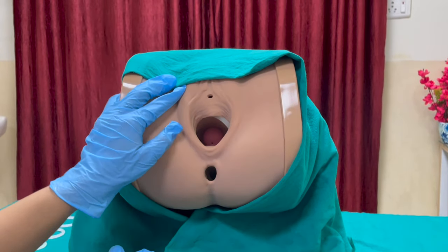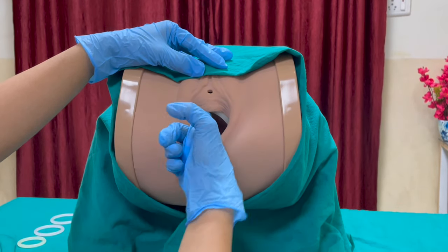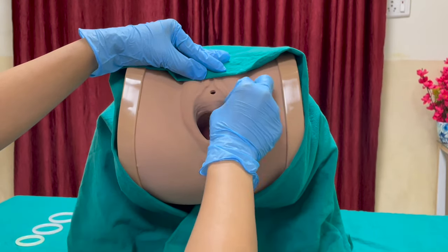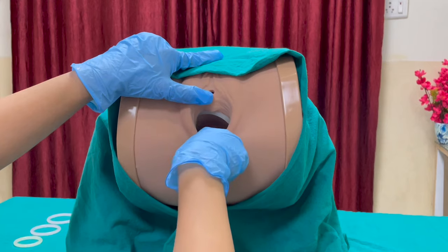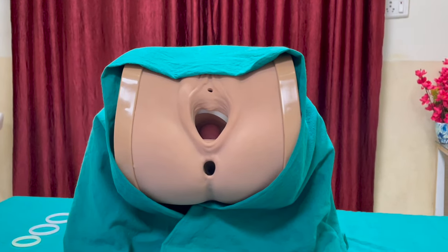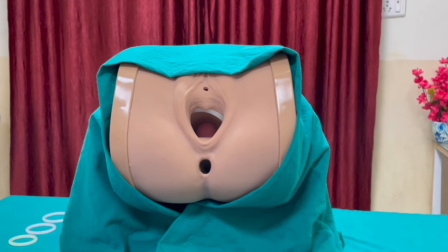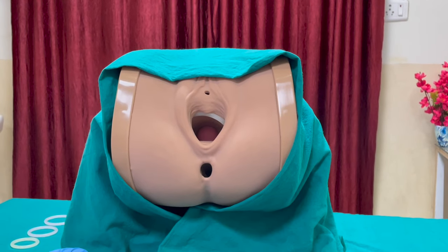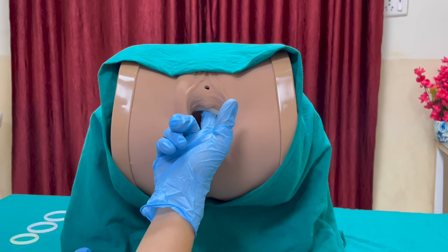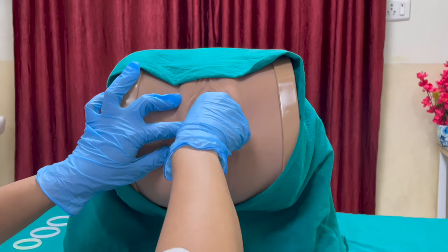Once it is fit in, check whether it is correctly positioned. Take an index finger, sweep through the perimeter of the pessary, and check for any pressure points. Then perform a fit check by asking the patient to do a Valsalva manoeuvre or cough continuously on the table to see if the pessary falls out. If it does, the wrong size was used or the patient is not a suitable candidate for a pessary. To remove it, insert a finger into the inner circle of the pessary, twist, and remove it.